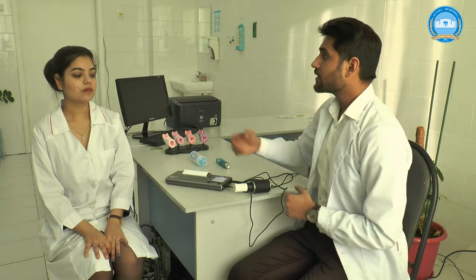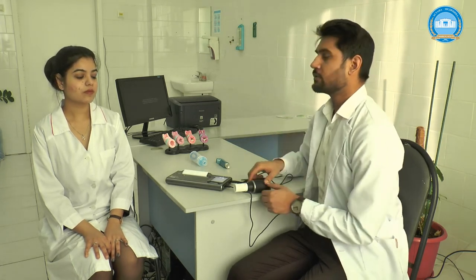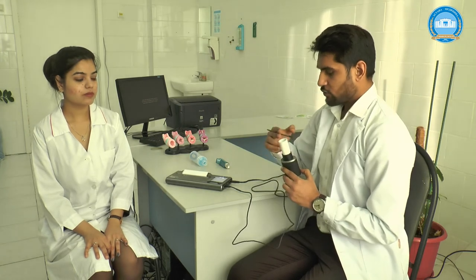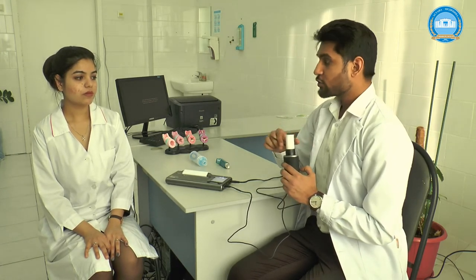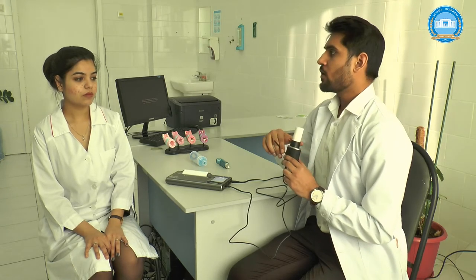The doctor needs to explain and show the patient how to perform the breathing maneuver correctly. During the procedure, the doctor should be attentive to the feelings of the patient.